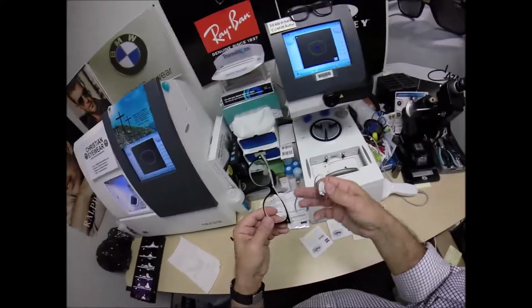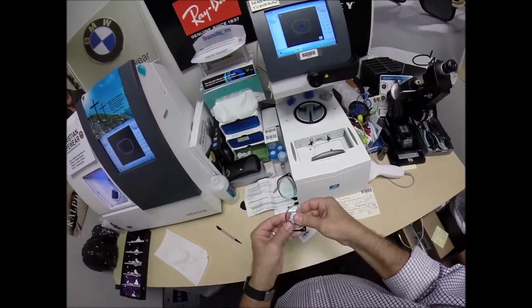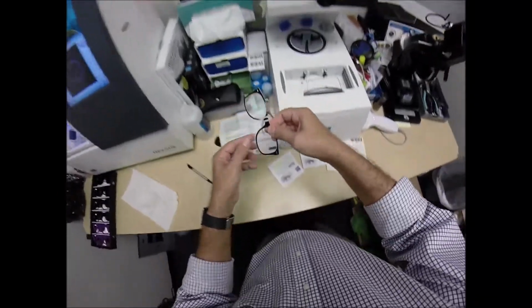So again, I'm going to see if this fits. I have the side I'm working on closest to me. I'm not trying to reach across. Tuck it in at the outside corners first. Using my thumbs, press down at the nose.